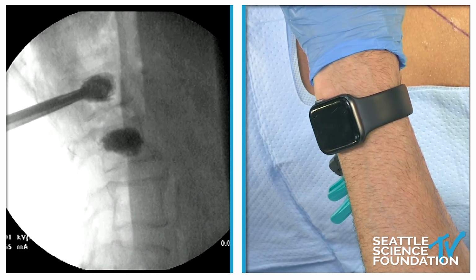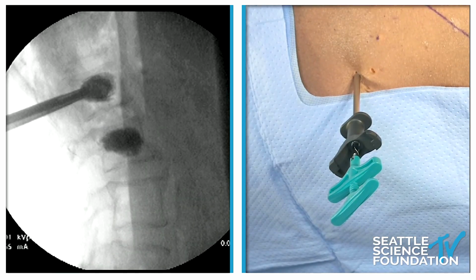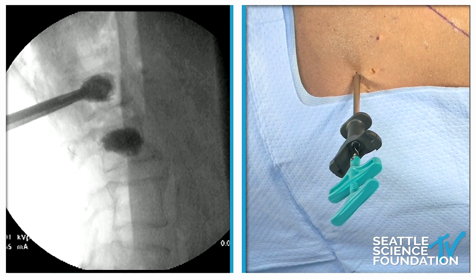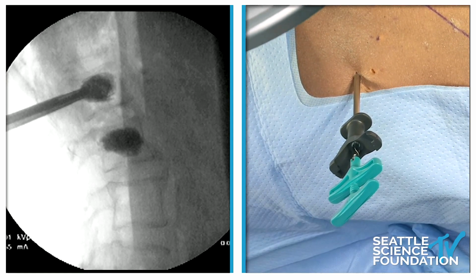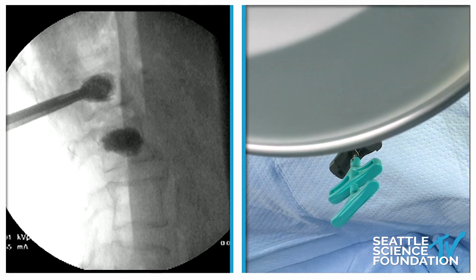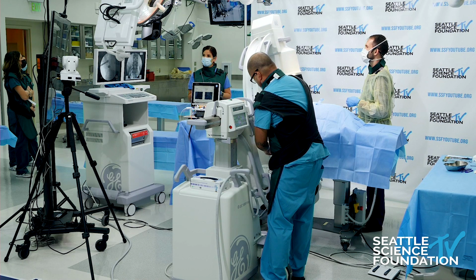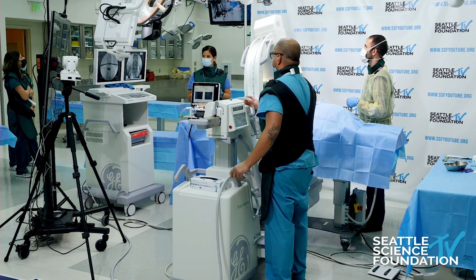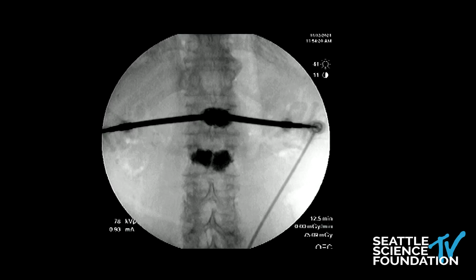Okay, hold off right there. And so I want to take an AP shot since we haven't looked AP yet. We've done that just for the sake of brevity. We don't want to take forever at this, but this is something that we always want to check in the AP and lateral shots before we deploy, after we deploy, and as we're doing the cement fill to make sure we have adequacy of cement fill. So that's very good. If anything, we might be slightly to the right of midline, which is fine. So in that case, we'll inject more cement on the patient's left.